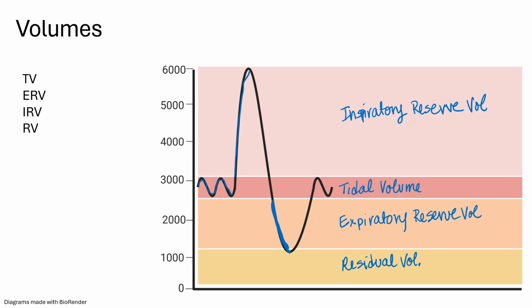And it's usually provided on a standardized chart, and you usually have to look it up. And the chart is based on measurements from cadavers. And the chart's kind of like a BMI chart. You look up how tall you are, how much you weighed, and then you can kind of see the residual volume. So I can measure these three things here. I cannot measure the residual volume.